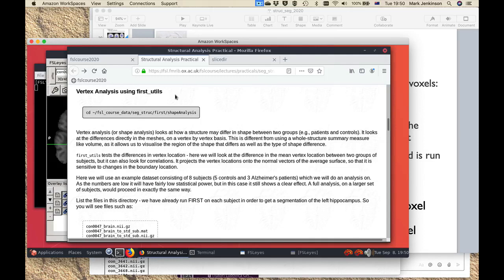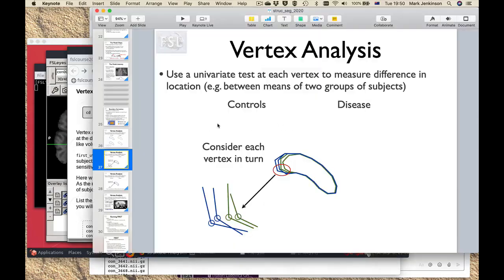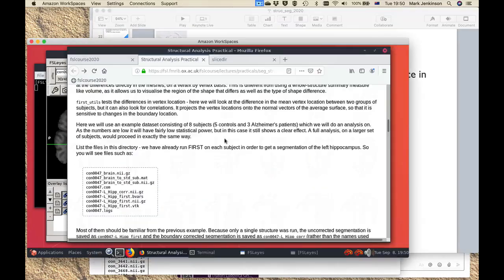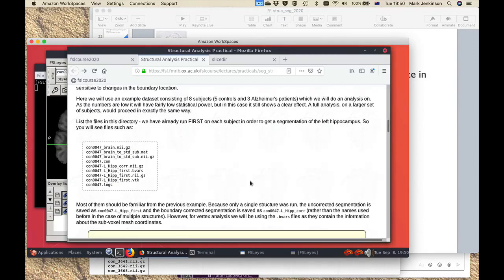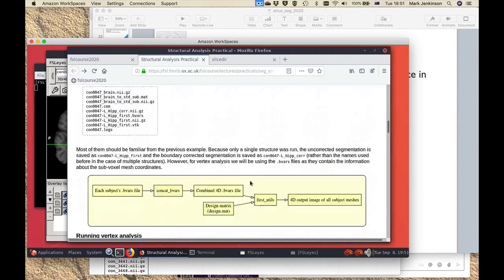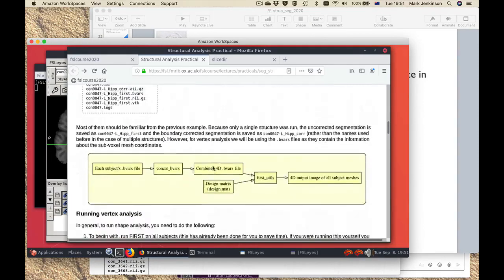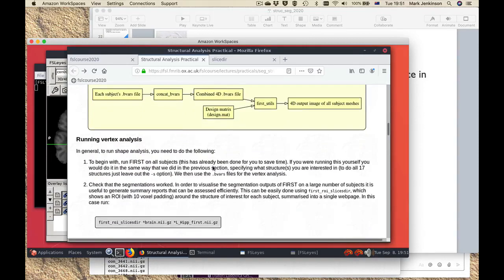The next section looks at how to perform vertex analysis when you've got a group of individuals and you want to see differences in shape. This relates to the section of the lecture where we talked about vertex analysis. In this practical we have a small selection: a group of eight subjects — five controls and three Alzheimer's patients — and they're different enough that you will still see a significant effect. All of the original segmentations have already been done for you, individual segmentations of each subject just like we were doing in the part beforehand.